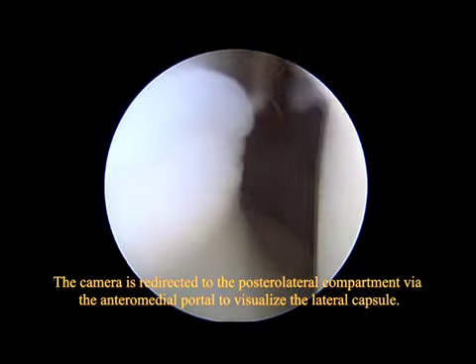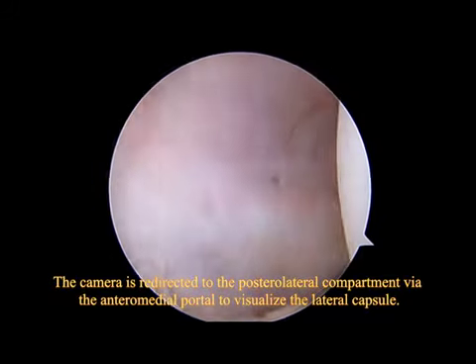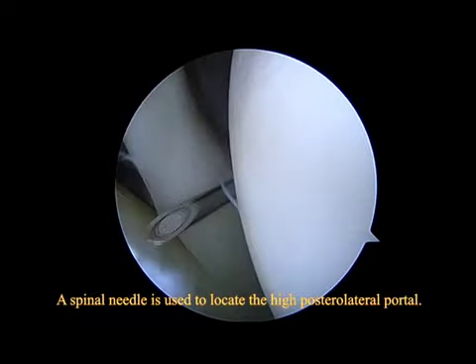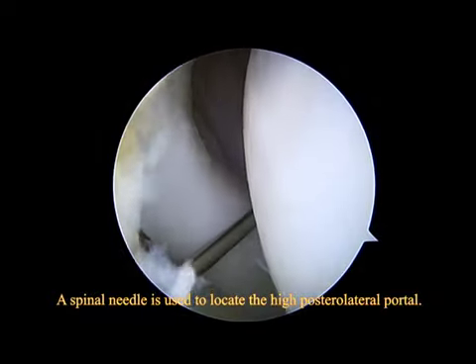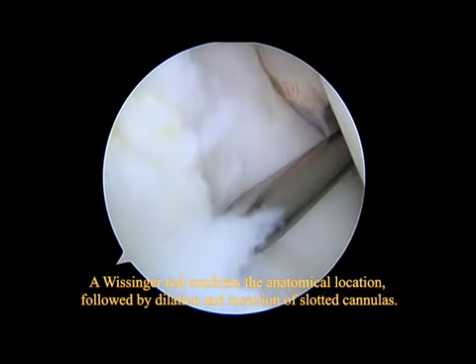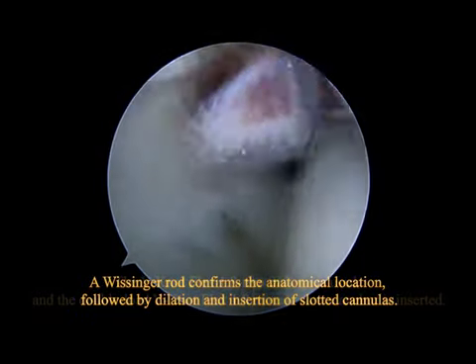The camera is redirected to the posterolateral compartment via the anteromedial portal to visualize the lateral capsule. A spinal needle is used to locate the high posterolateral portal. A Wissinger rod confirms the anatomical location, followed by dilation and insertion of slotted cannulas.